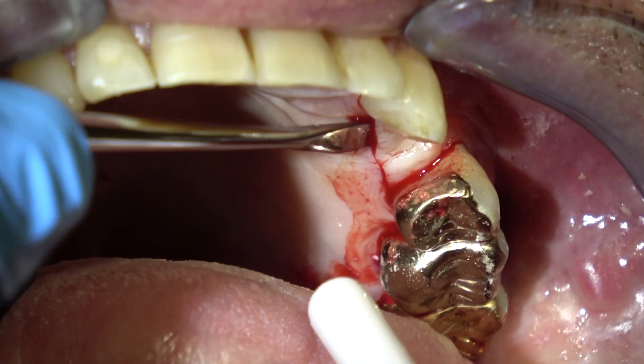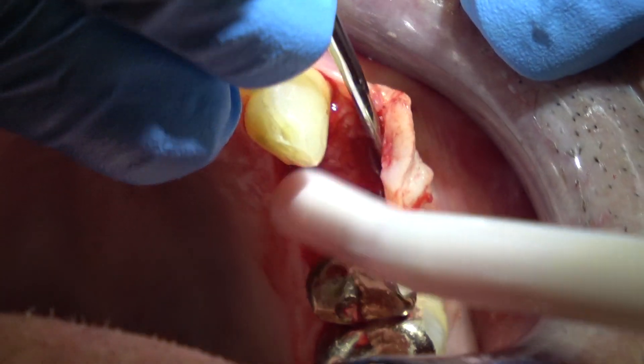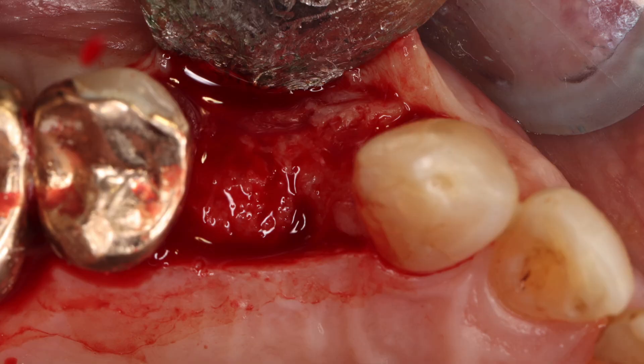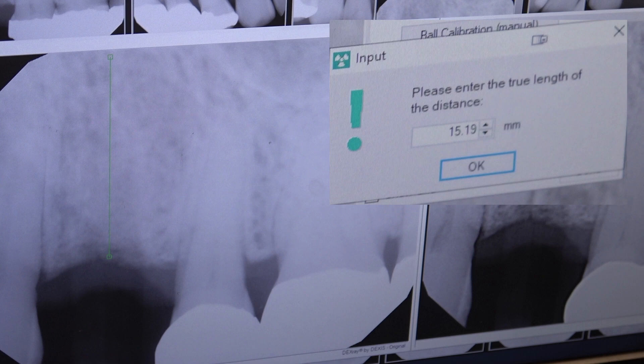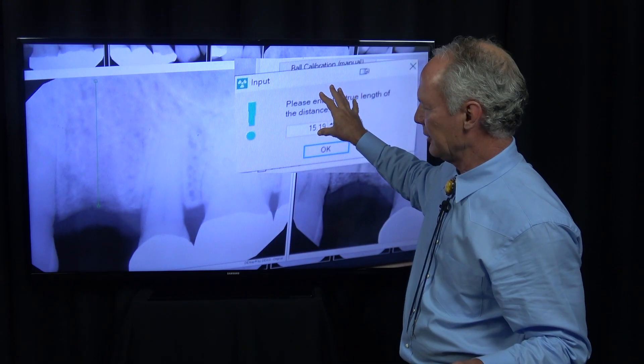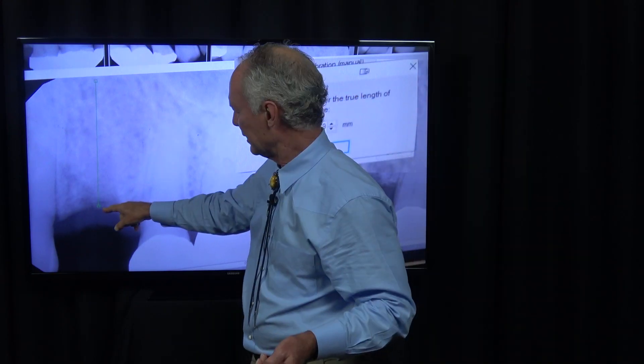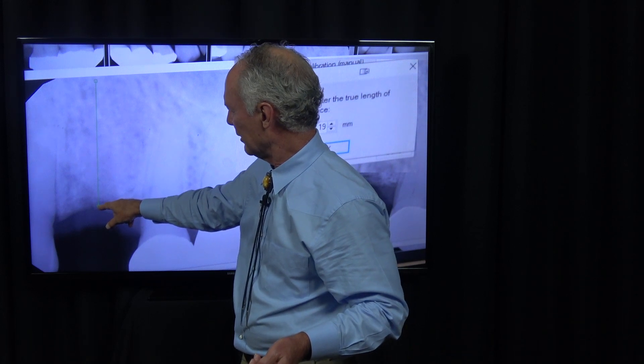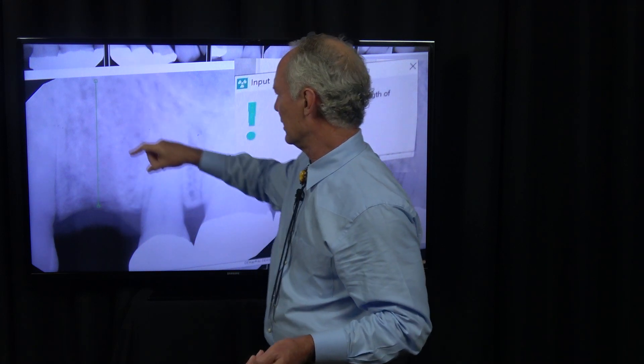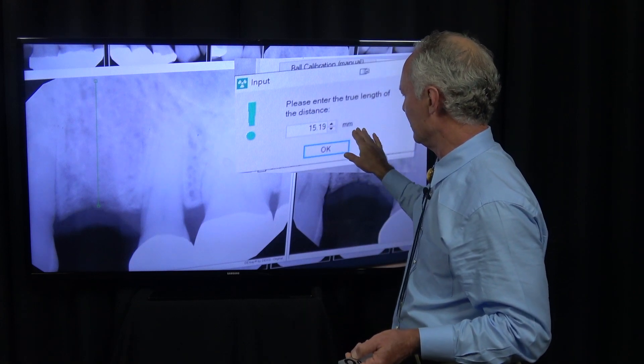This is a periosteal elevator for a full-thickness flap. You can see how solid this is. Now I'm using my application to take a radiograph from the alveolar crest apically to see how much room I've got. I've got plenty of room.